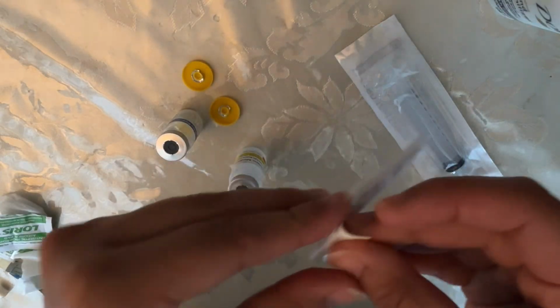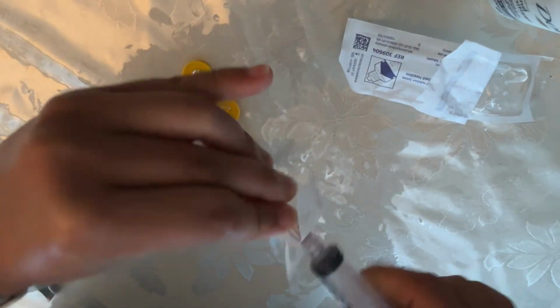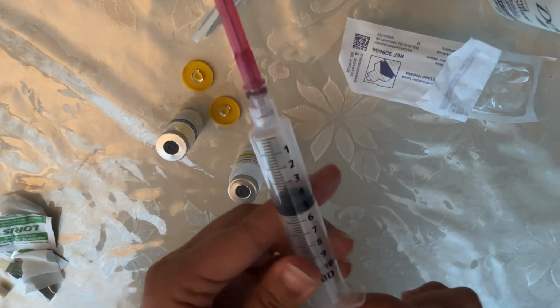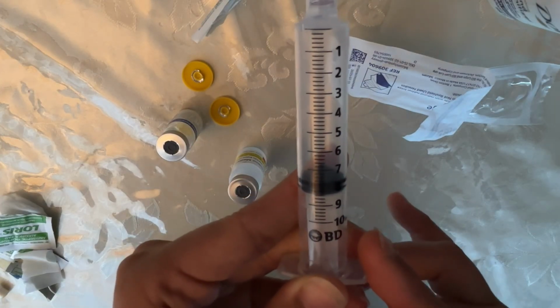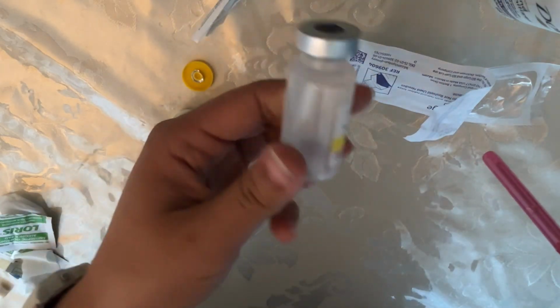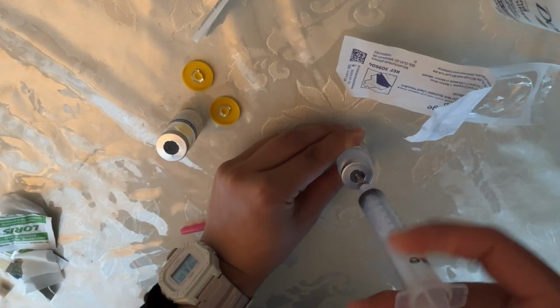I'm just going to go ahead and open my blunt needle and my syringe. Touch them together. And I'm going to draw, based on the instruction, 7.7 ml sterile water. I'm just going to inject air, 7.7. This is my sterile water. Go ahead and inject the air and draw 7.7.